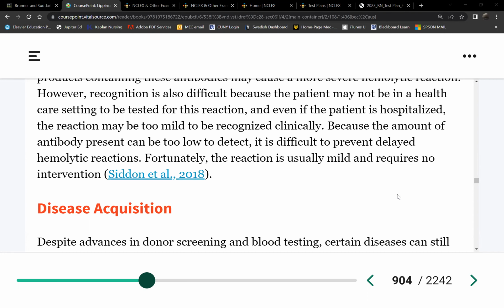This bag, do you know how old this is? This blood, you know how old it is? How do I know how old it is? Okay, there will be a donation date here. So this one, it just says the expiry date, so I know it expires at some point.